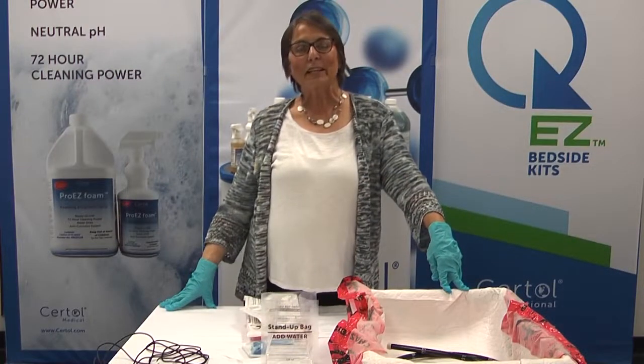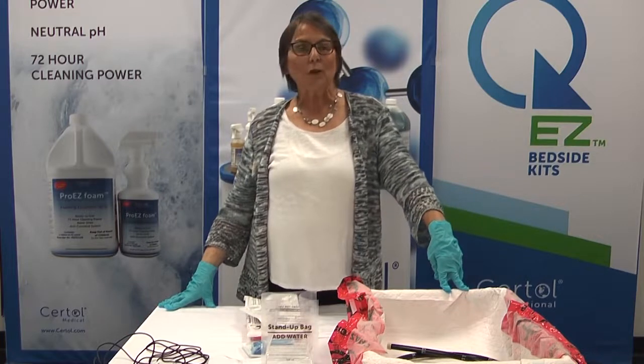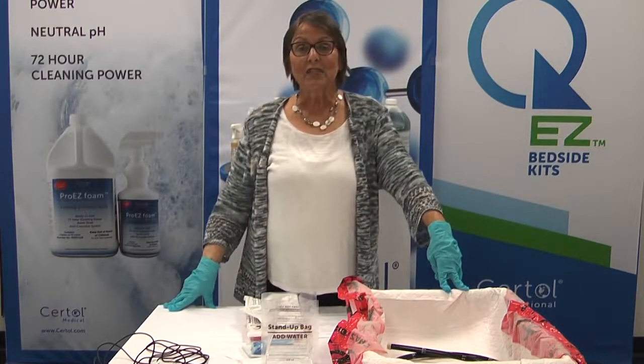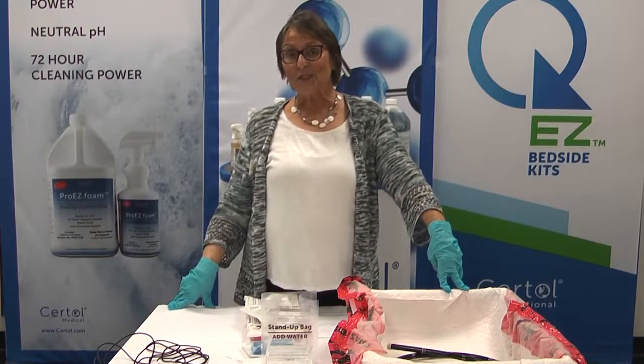Hello, today we're going to be talking about Certol's new QEZ bedside kits. These are for cleaning endoscopes immediately after treatment to prevent dried soils. I'm Peggy Spitzer and I'm clinical education manager at Certol.